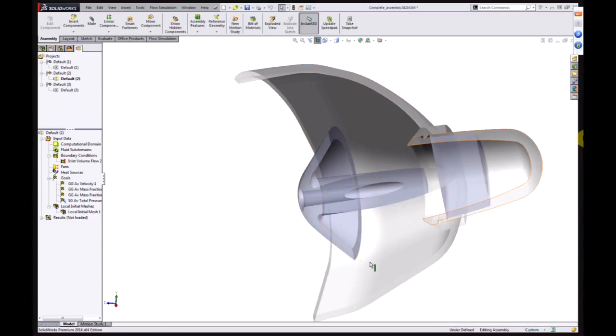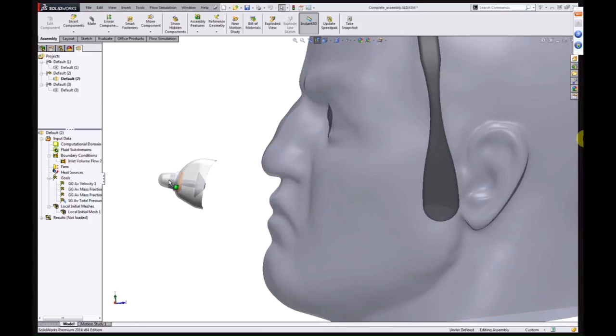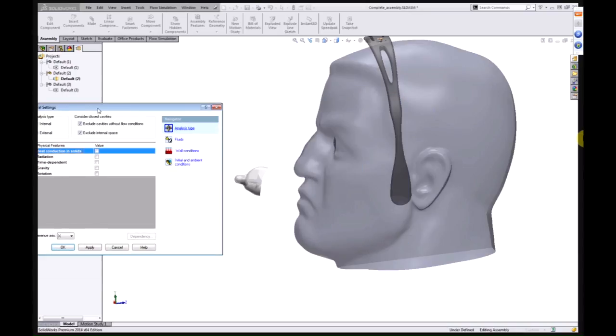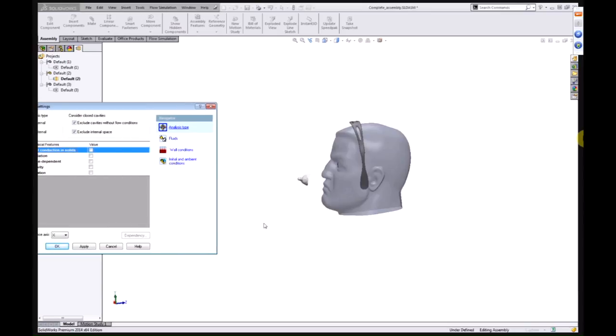And the setup for something like this is pretty straightforward in SOLIDWORKS Flow Simulation. Flow Simulation automatically knows where all the solid pieces of the model are, so we just need to tell it where to define the fluid region. We've identified a fluid region just by specifying some XYZ coordinates or push-pulling a box on the screen that encompasses the arm and the whole head. We're going to tell the software that we're considering a mixture of air and oxygen. And by default, everything in this box is considered to be 100% air right now.